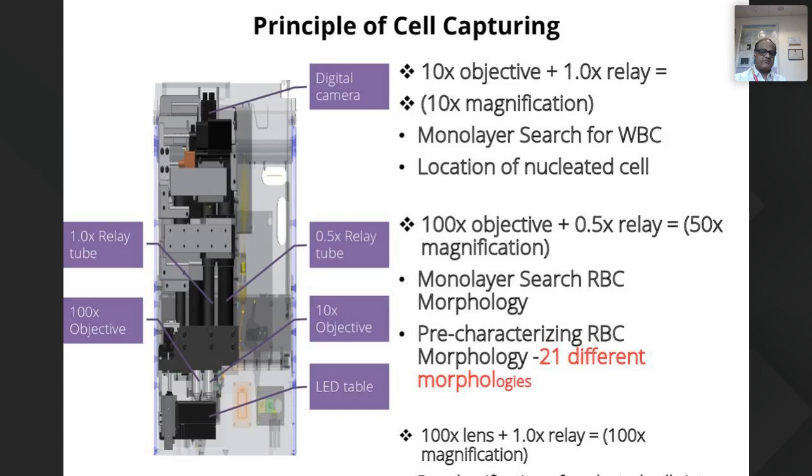Now, what happens in digital morphometry, what are we talking about? Understand that there is a small difference between whole slide imaging and digital morphometry, though you might have similar-looking optics. This is like saying you are welcomed aboard and the air hostess says you will be in a frequent flyer program, but this flight may have separate safety precautions.